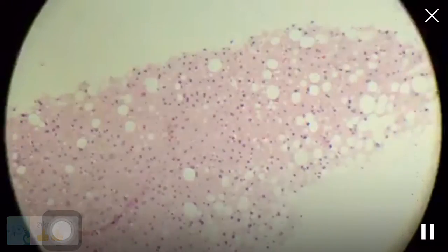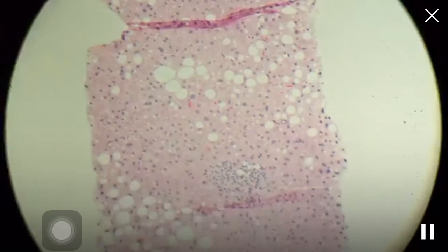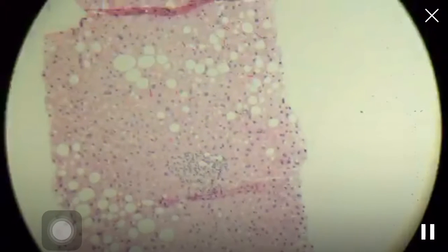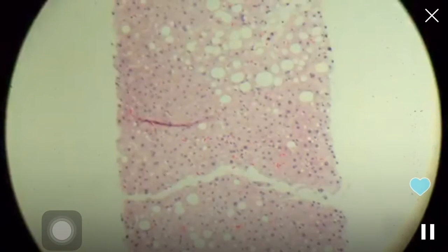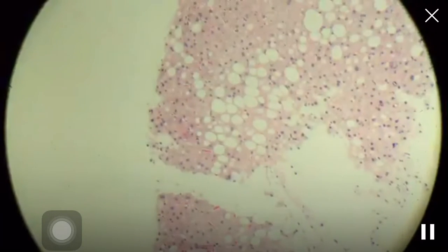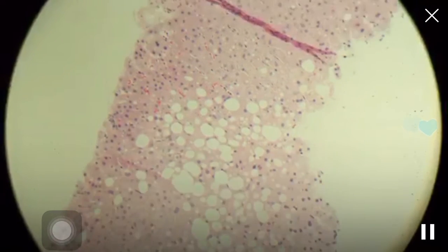And I'm not impressed by the steatohepatitis. A little bit of mononuclear infiltration in the portal tract, scant to mild. We see that with non-alcoholic fatty liver disease. I don't call that steatohepatitis without the other stuff. Maybe that will change in coming years, but right now, that's the standard. We're still looking for the classic features. So I don't think there's any steatohepatitis.